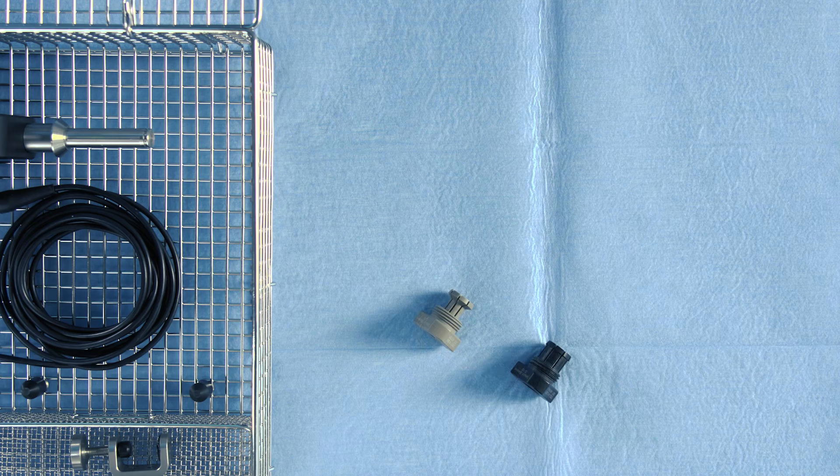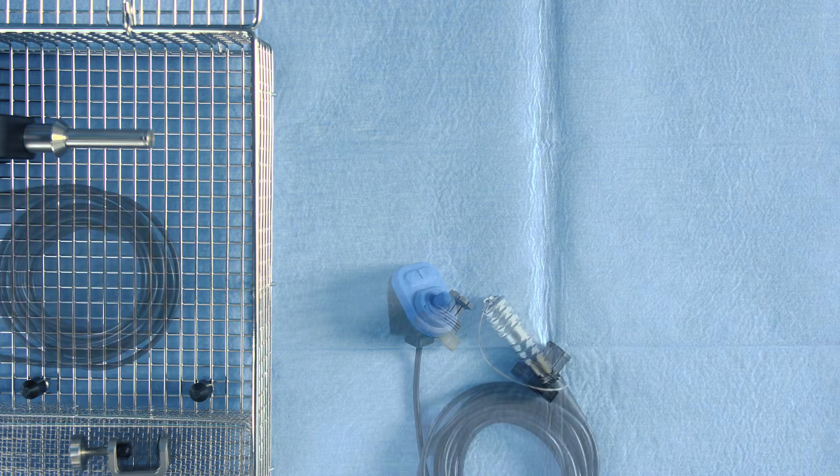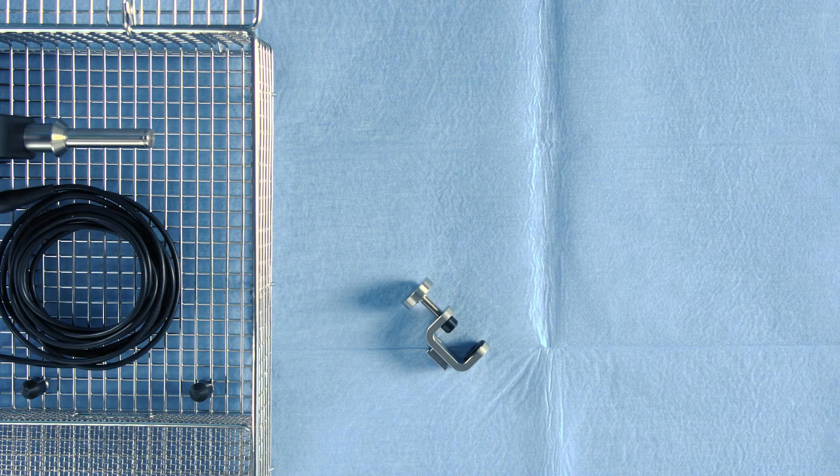Also included are tension sleeves for 5 and 10mm endoscopes, and a joystick with an instrument mount and a sterile drape.